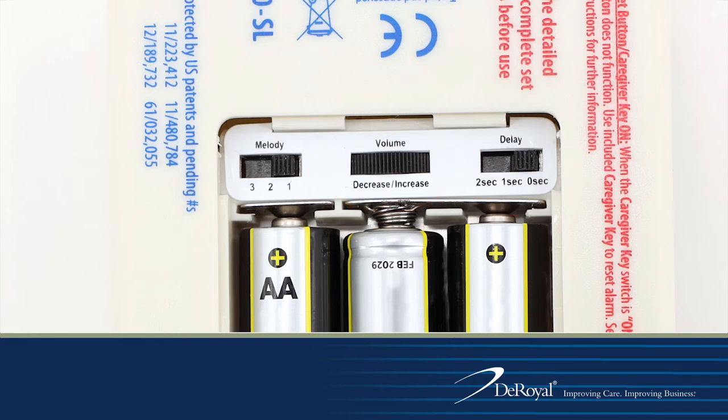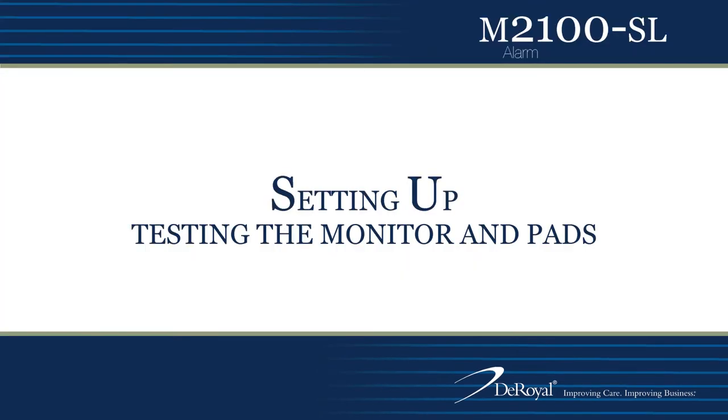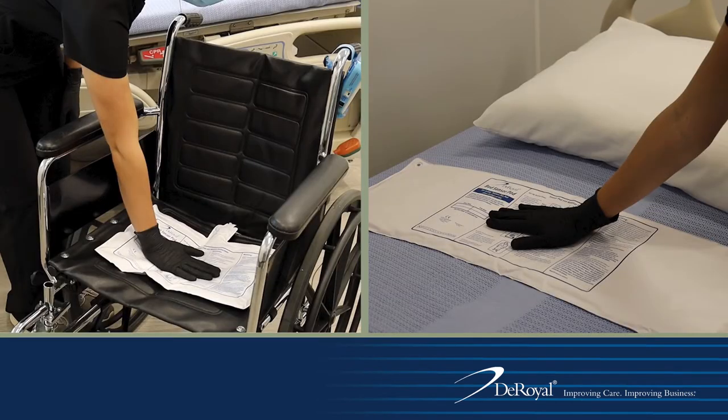Alarm tones, volume, and delay option selections should be based on facility protocol. Always test the alarm monitors and sensor pads before using them to ensure that they are functioning properly.